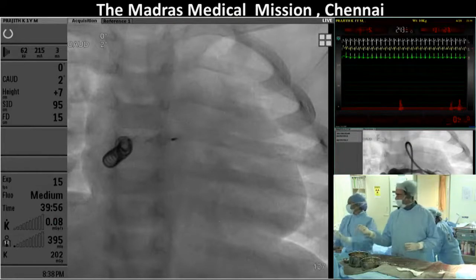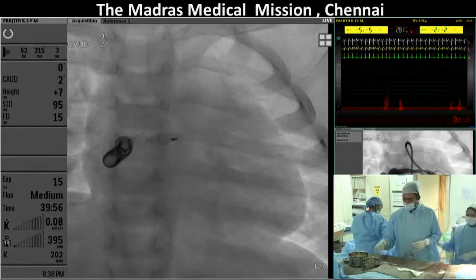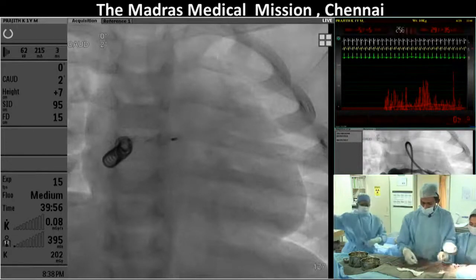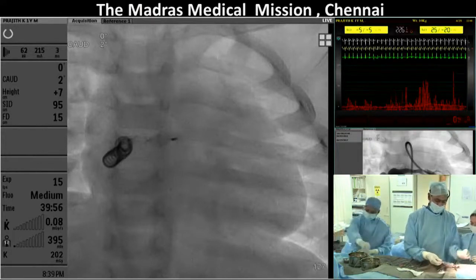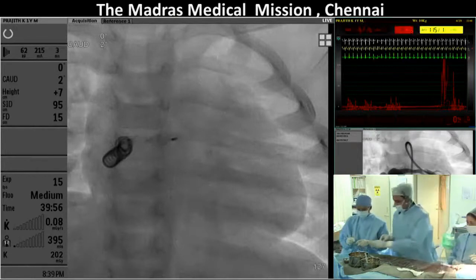To me, this occlusion system right now looks very good. It's not exactly what was intended. And personally, I always think that an absence of vice in your personal life results in this kind of outcome. Right, Shiva, you'll have to tell your wife that.